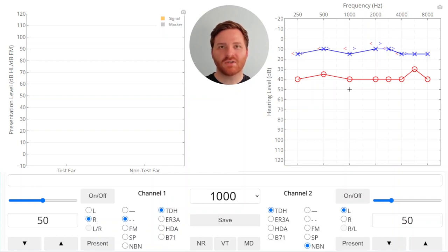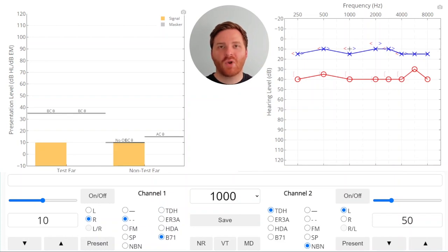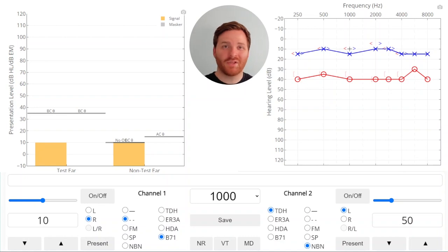Every time we present a signal to a listener, we're not just presenting it to the ear that we think we are. The sound from the signal in the test ear is also heard in the non-test ear, but the sound loses some energy as it crosses from the test to the non-test ear. Let's look at the bone conduction threshold at 1000 Hz for the right ear. When we place the bone oscillator on the right mastoid, we found our threshold at 10 dB HL. For bone conduction, there's an interaural attenuation of 0 dB, meaning when we put the bone oscillator on the right side, we don't really know if it's the right ear or the left ear that's responding.